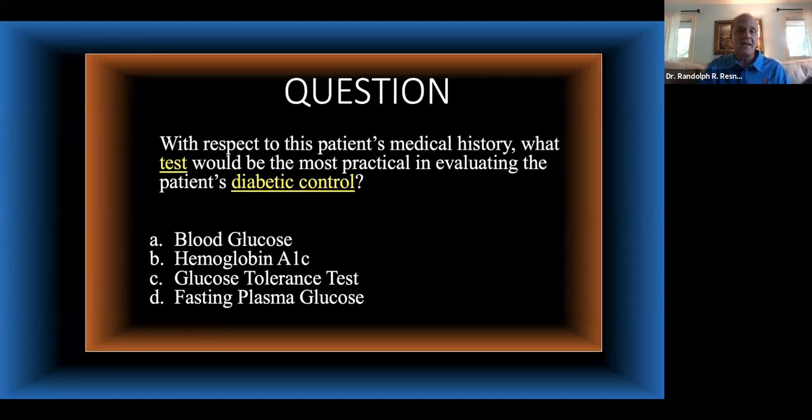We'll treatment plan it, and in the middle of the treatment planning session, we will break out and have questions. I will ask you questions that all of our attendees will be able to interactively join in and answer. After you answer the question, we will give you the polling and show you what other attendees marked as their answers, and then I will explain the correct and the incorrect answers.